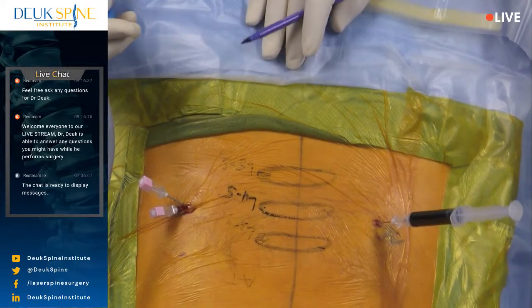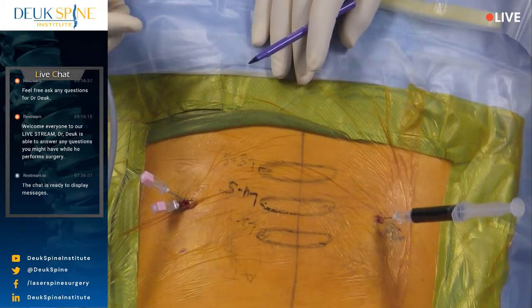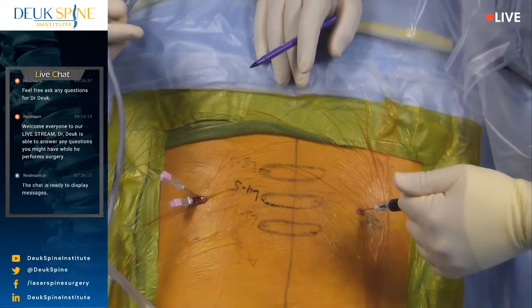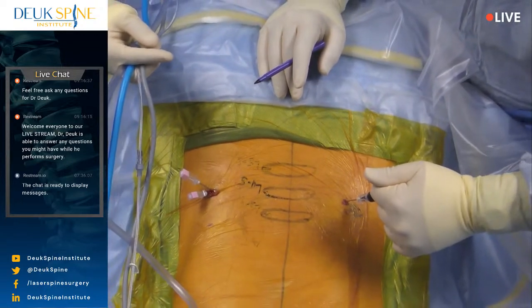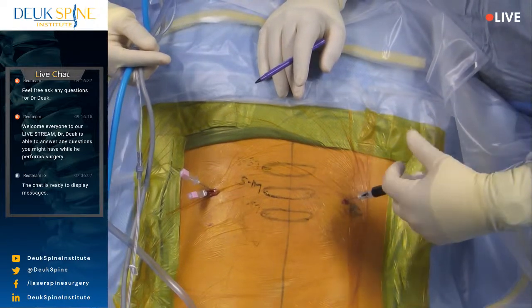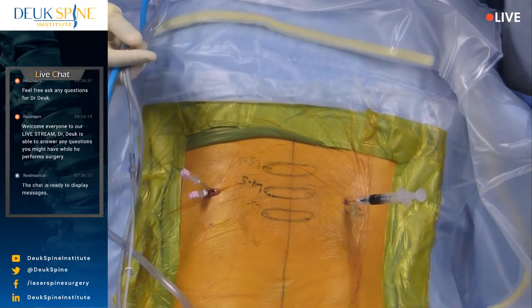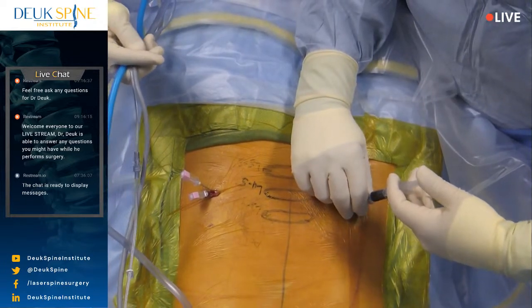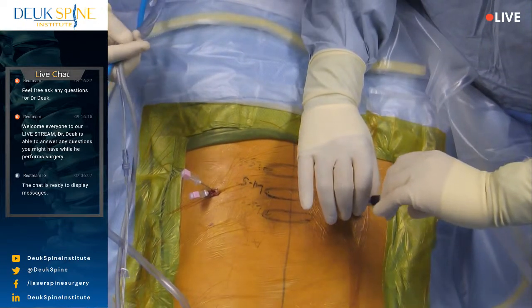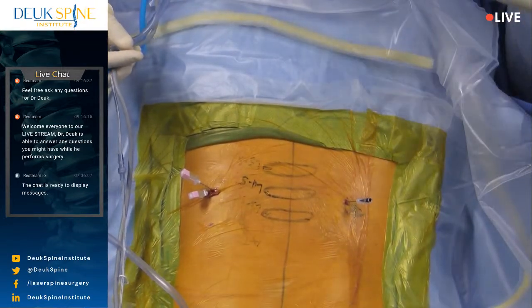Are you comfortable? Remember, the patient's awake up to this point. Are you comfy? All right. How bad is that on a scale of 1 to 10? How much is it? 3. All right. Actually, that last part got some of the posterior tear because I think I was a little far. All right. Is that where you typically get pain? Yes. Yeah. So he calls it a 3 out of 10 concordant.